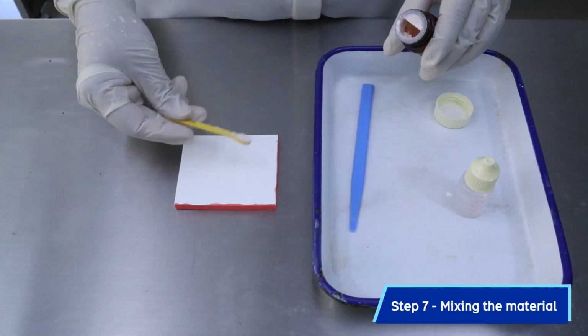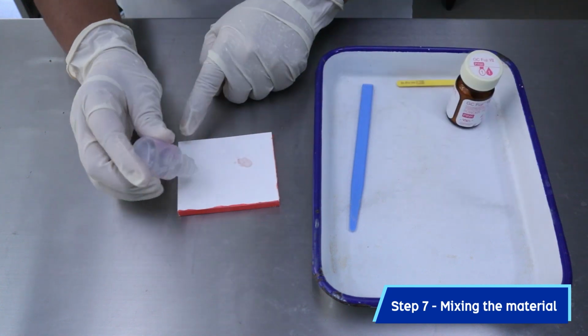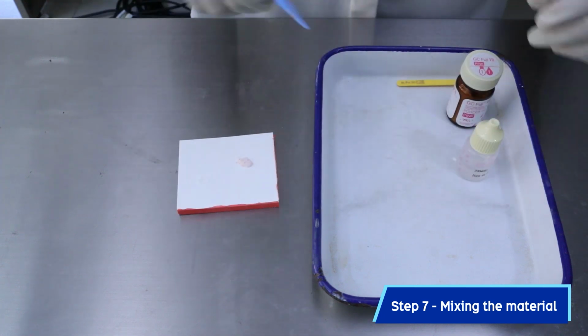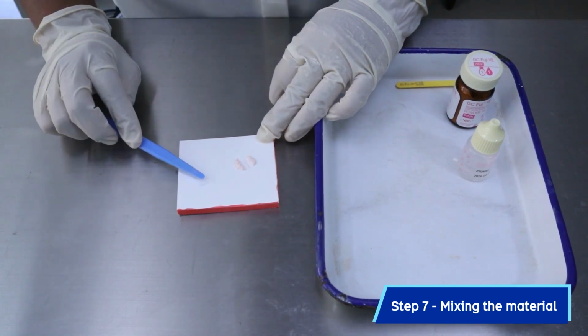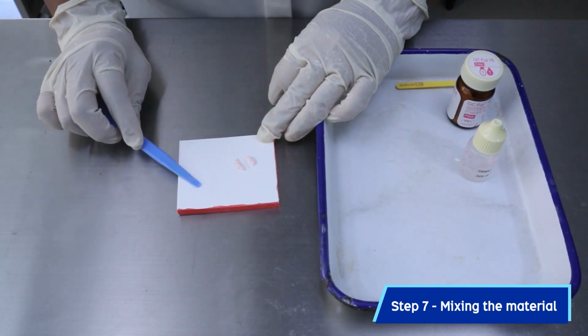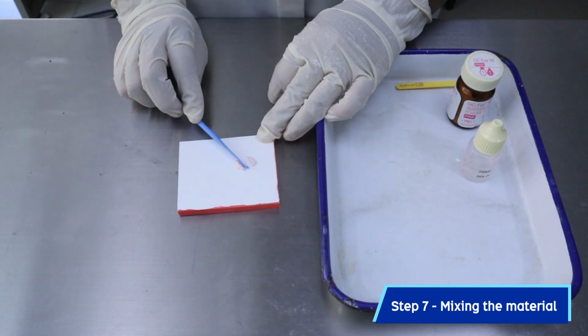Mix the sealant according to the manufacturer's instructions. Dispense 1 level yellow scoop of powder with 1 drop liquid onto the mixing pad. 1 level yellow scoop of powder would be sufficient to seal 2 molar teeth. Dispense the amount according to the number of teeth to be sealed in order to minimize wastage.